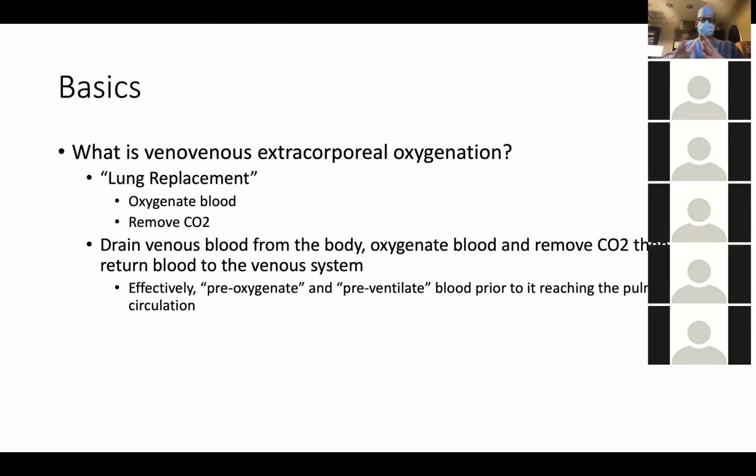So basics. What is VV ECMO? The best way to think of veno-venous ECMO is lung replacement. It does the same things your lungs do. It can oxygenate blood, it can remove CO2. It does not provide any significant cardiovascular support and doesn't treat shock.